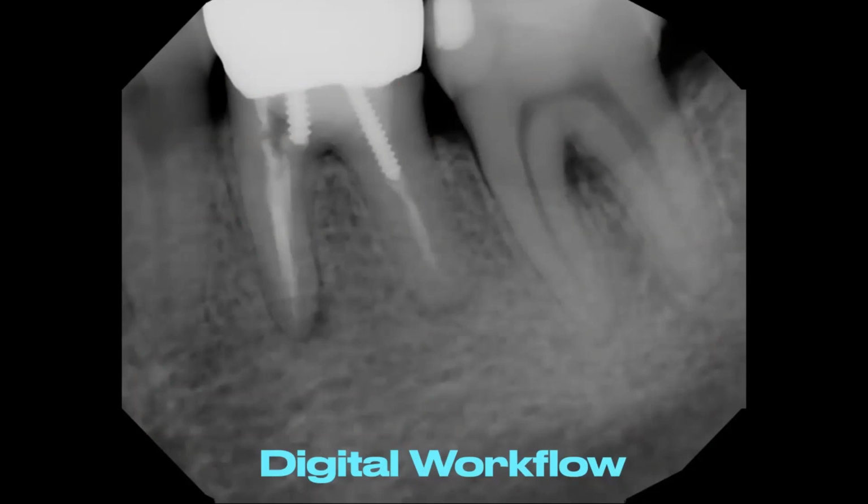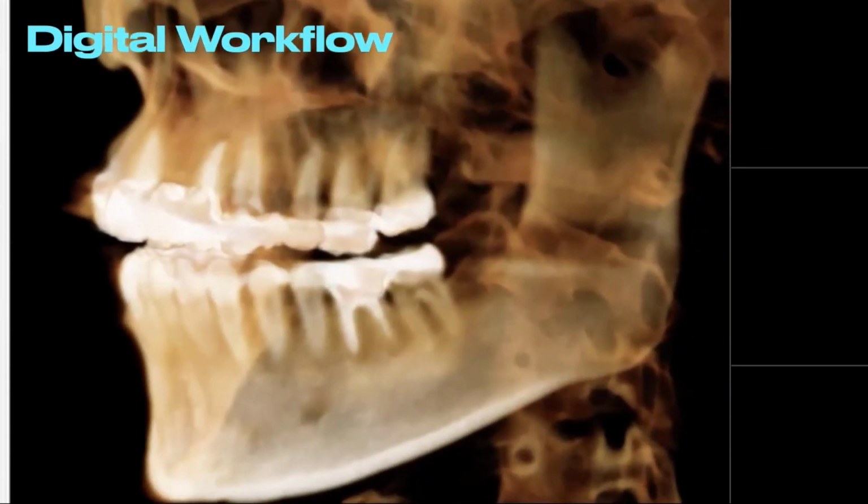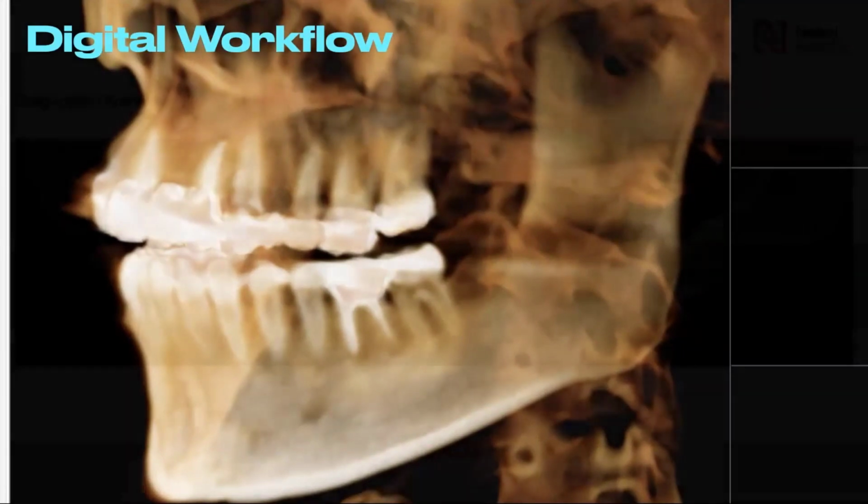There's a bit of a shadowing on the mesial root. The distal root also has a little bit of a shadowing at the apex, but do you know if it's cracked or not? How do you tell? I'll tell you that if you send it to an endodontist, the first thing they're probably going to do is take a CT. And so having that in your office allows you to really diagnose a lot more treatment so you can see it. And so when we treatment plan the case and we take a look at what's going on, we can really see, we can look at the image, we can spend time to make sure that we know what's going on and really just visualize things on the CBCT so we know where we're headed.